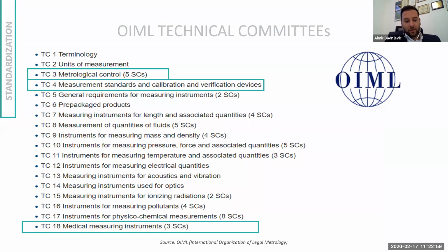When we are talking about metrology, when you want to use legal metrology, there are different kinds of committees under the OIML, as they call it. So when we check what they are doing from the point of view of medical devices, we can find out that just three different technical committees are doing something which is directly related to medical measurement. So these are the three marked here, but the most important is technical committee 18, which is, in fact, medical measuring instruments. And it is led by the German PTB.